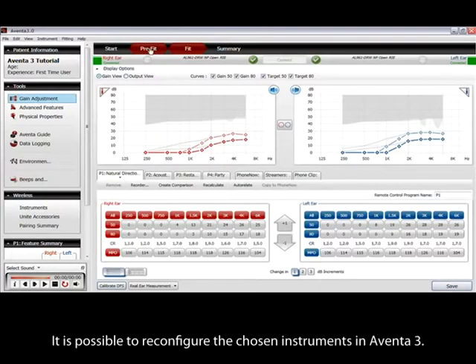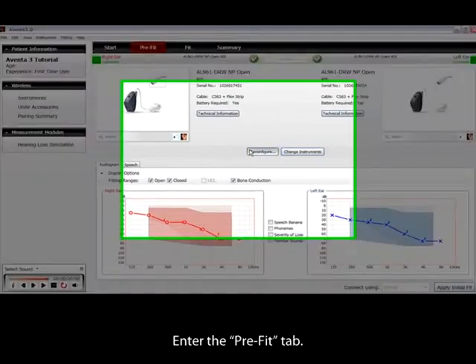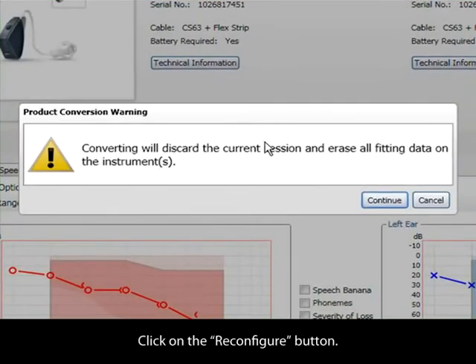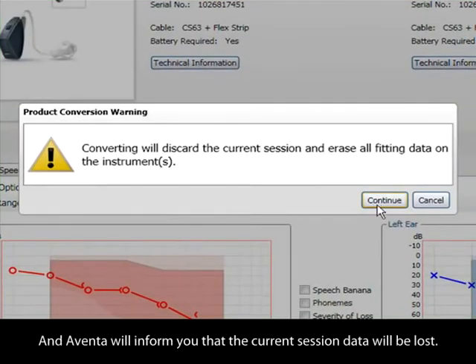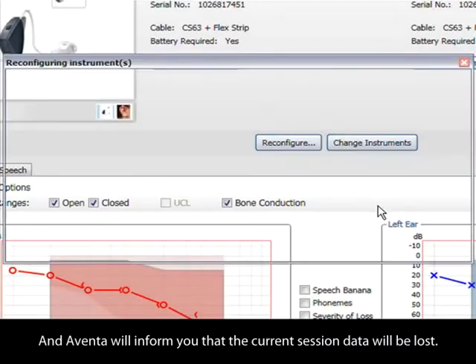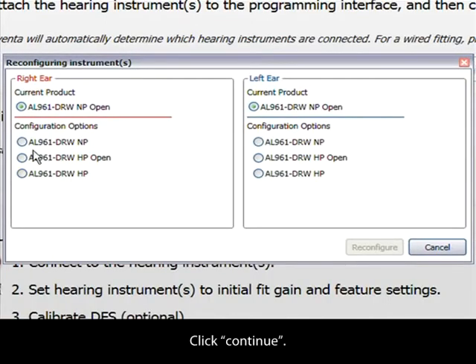It is possible to reconfigure the chosen instruments in Aventa 3. Enter the Prefit tab, click on the Reconfigure button, and Aventa will inform you that the current session data will be lost. Click Continue.